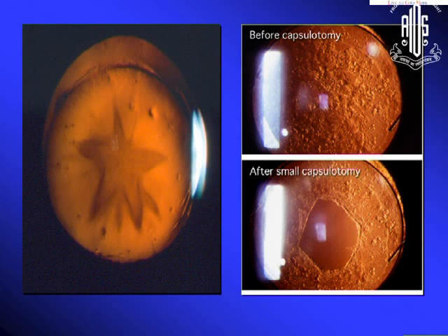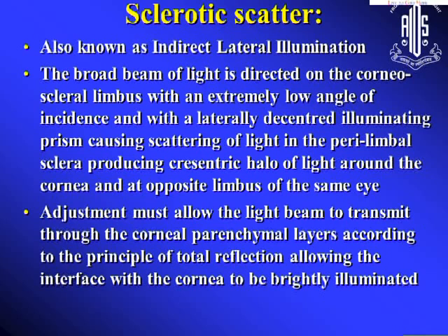But if you see it in retroillumination from the fundus, the moment you see these bubbles apparent, you immediately know that this is the culprit why the vision is reduced so much. Similarly, with the cataract, you can know exactly what type of cataract the patient has. Once you do the YAG capsulotomy, you can see it's absolutely clear. So these pictures you must utilize. But for this, it is preferable to dilate the pupil and then do it.